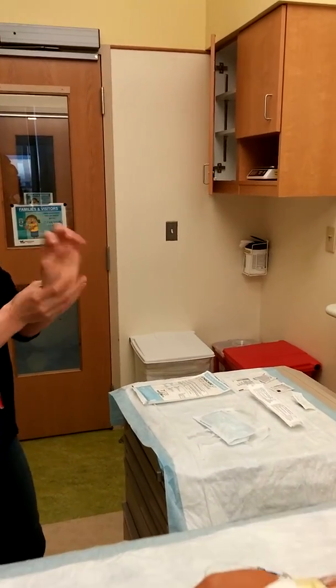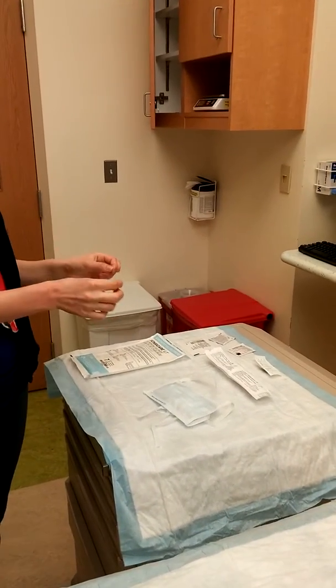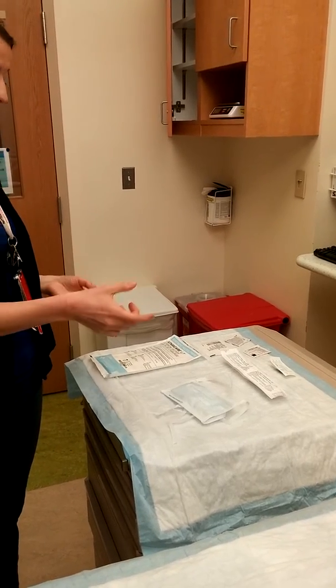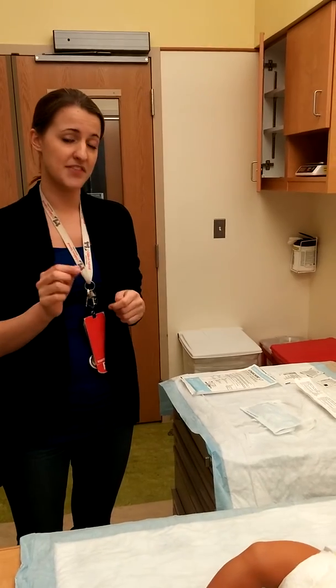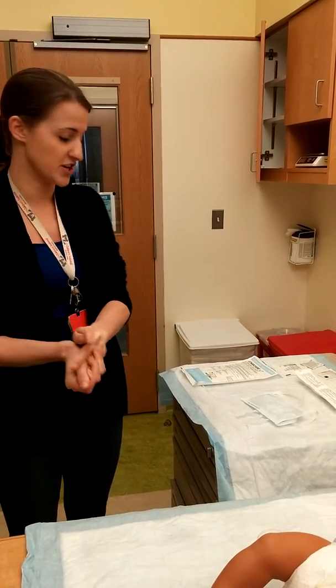The supplies you'll need to gather are a mask, a set of sterile gloves, a 10cc sterile saline flush, a gauze, a sterile cap, and two chlorhexidine pads — not the swabs. The pads will allow for better friction, which is required for CHG.